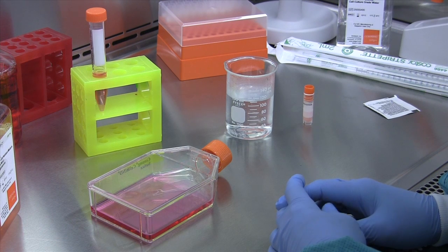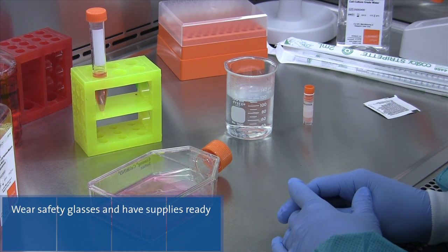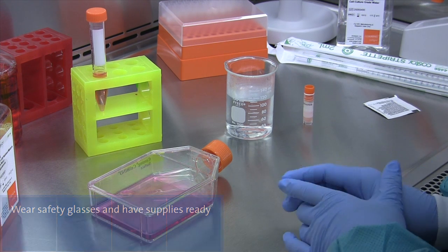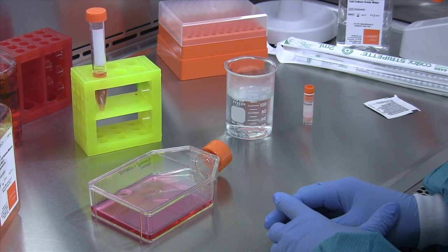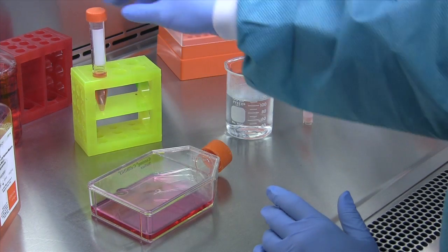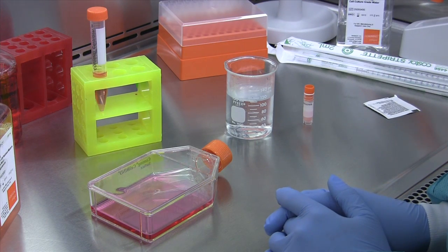Unlike freezing down your cells, thawing out your cells is a rapid process. Therefore you want to have all of your supplies ready. Here I have a beaker filled with pre-warmed water, a flask with pre-equilibrated media that was in the incubator, and I also have a conical vial with media in it in case I choose to spin down my cells to remove the DMSO.